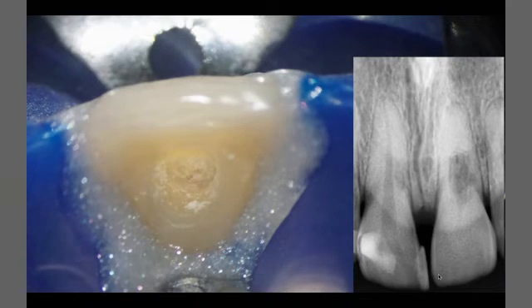As usual, start with your initial outline. In anterior teeth it is a different story. Why am I showing this case? Because in anterior teeth, the calcified tissue forms a ring calcification. It's called ring calcification. We have a dark spot. We don't have a floor map here, because this is a single-rooted tooth. So we will see only a dark spot.